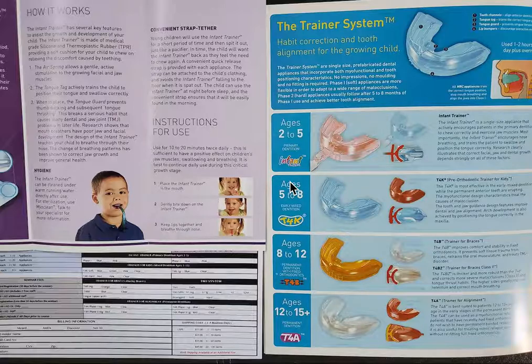This is a no promises thing. Of course, it's based on compliance, right? So if the patient's not wearing it, it's not going to work. Not much else you can do at that age. I wouldn't be doing anything fixed in the whole 2 to 7, 2 to 8 age range. I don't normally glue anything on teeth. It's a little too brutal. Starting at age 7.5, 8, we can move on to more complex appliance systems.